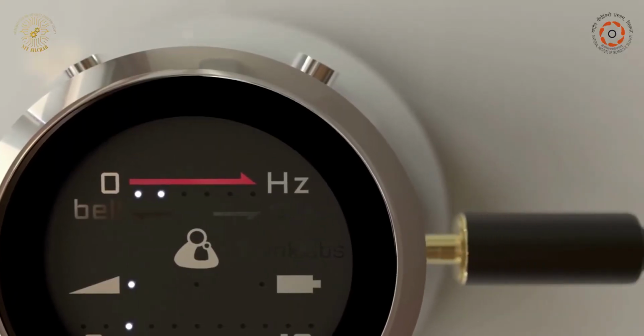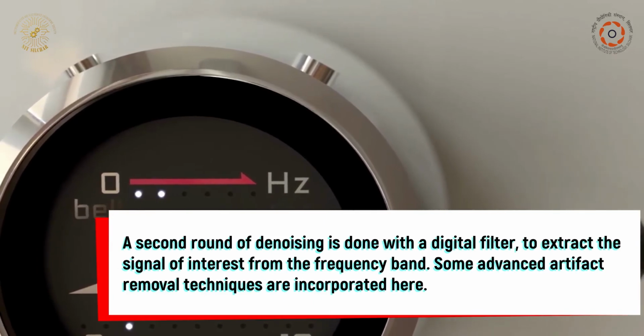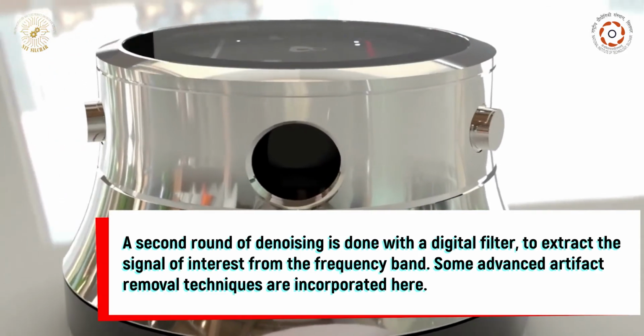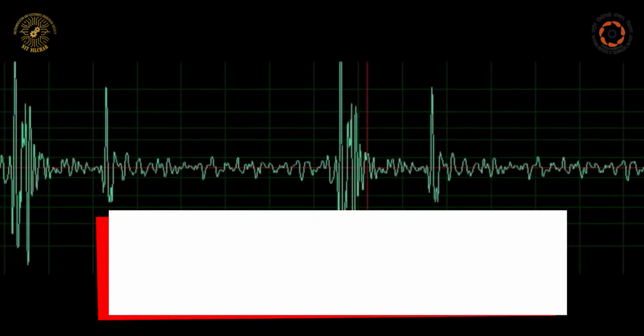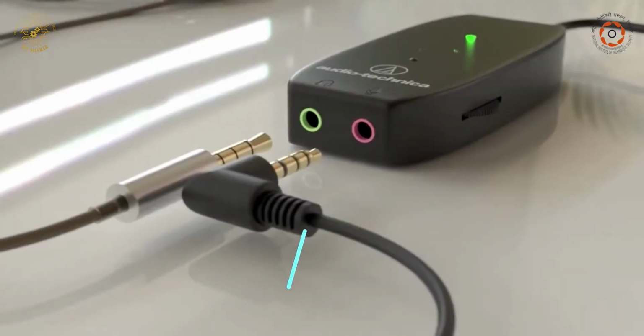The second step is the pre-processing module. A second round of denoising is done with a digital filter to extract the signal of interest from the frequency band. Some advanced artifact removal techniques are incorporated here. The heart sounds obtained in the process are normalized to a particular scale and are segmented into cycles. This helps us in detecting the heart sound components clearly.